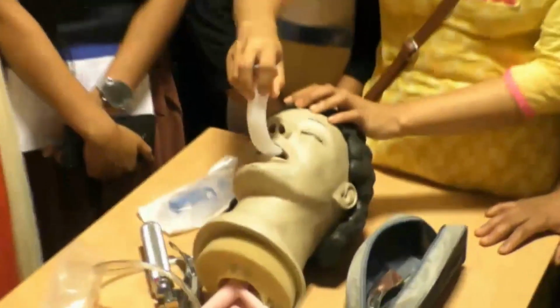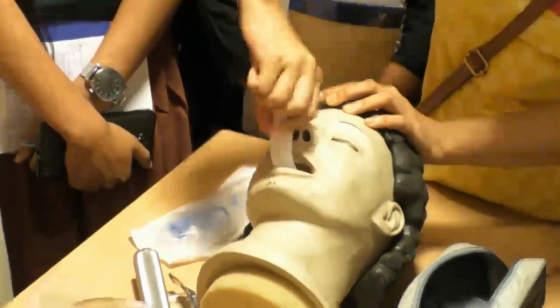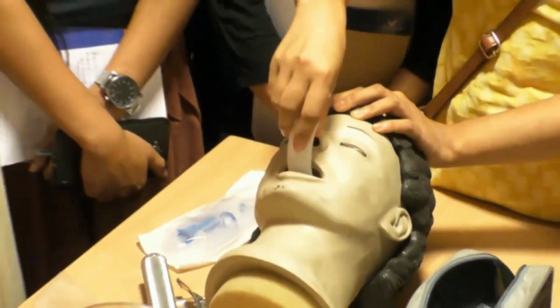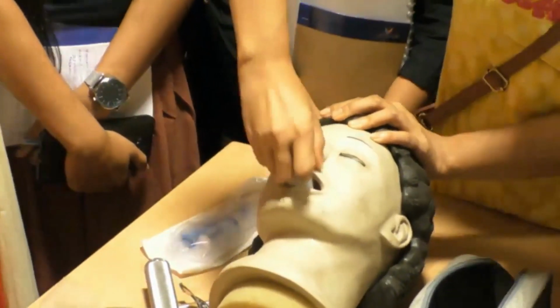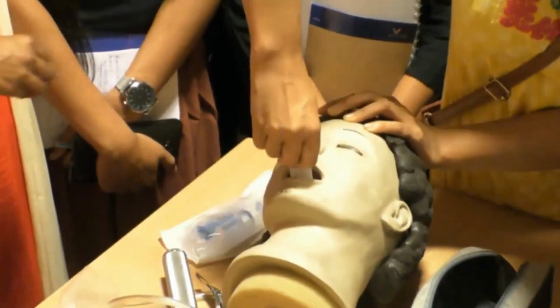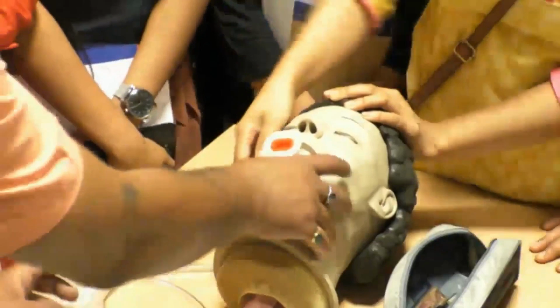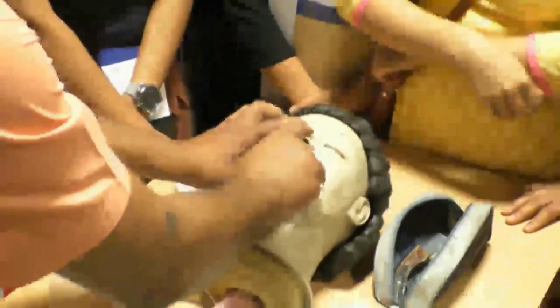Okay. How to insert this? Can anyone show? करो, do it. ठीक है ठीक है ठीक है.